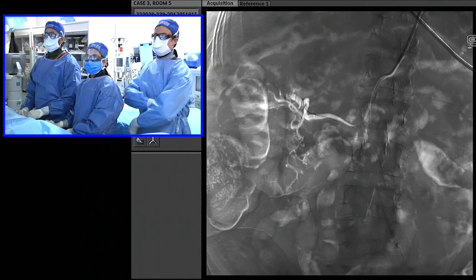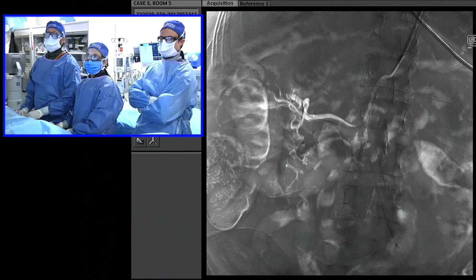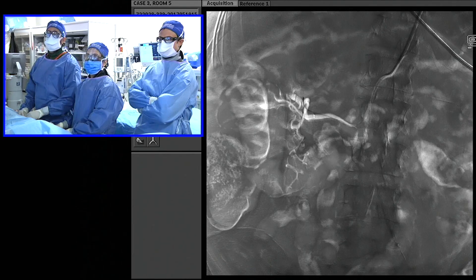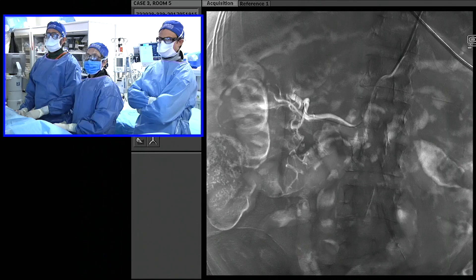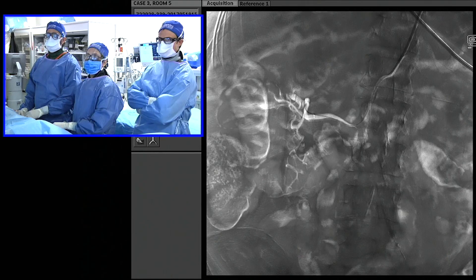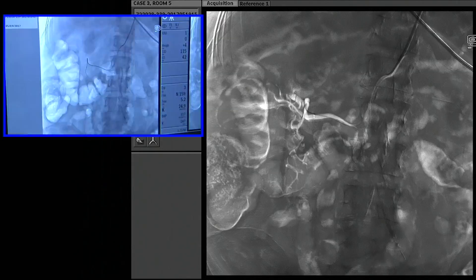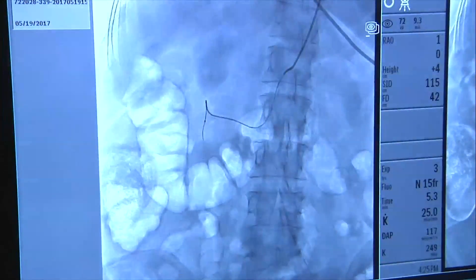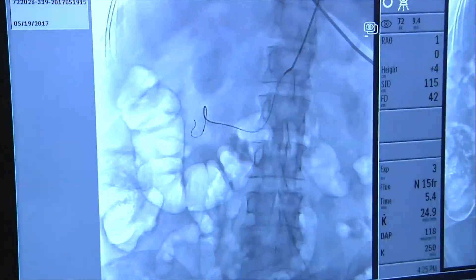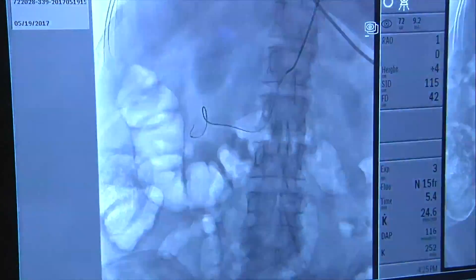What we have in this patient so far is basically a 5 French sheath from the wrist, and then we took a 2.4 French low-flow microcatheter. This is a 155 centimeter microcatheter, which I think is ideal for GI bleeds because it gives you an extra five centimeters, which helps a lot when you're trying to get to these distal branches — whether it's in the colon, sigmoid, or something like that. Even rectal bleeds you can reach pretty easily from the wrist.